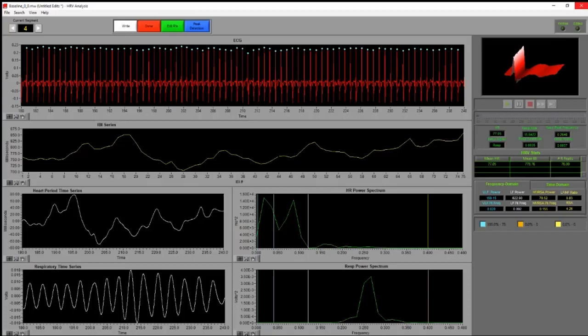You can actually upsample the BioNex to above that if necessary. It usually doesn't result in any additional information. It's just larger data files. But yeah, those are some of the differences between the two. Certainly the sampling rate is 500 for the mobile, 1,000 natively for the BioNex.